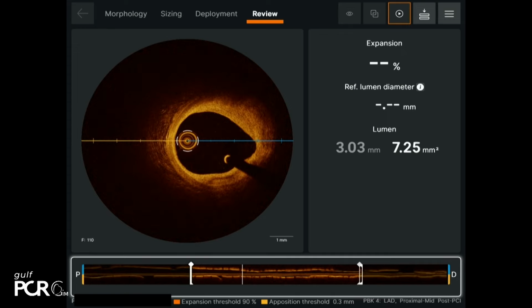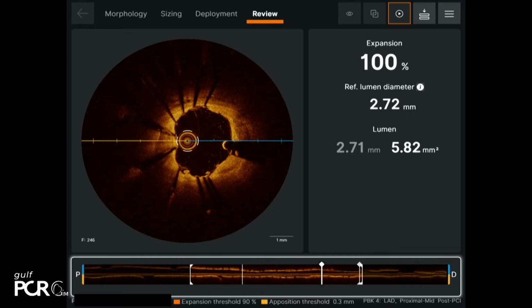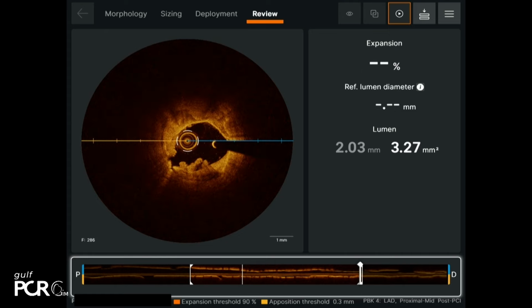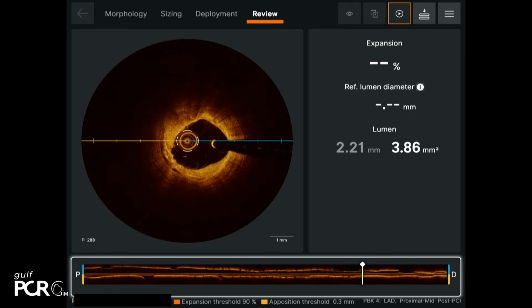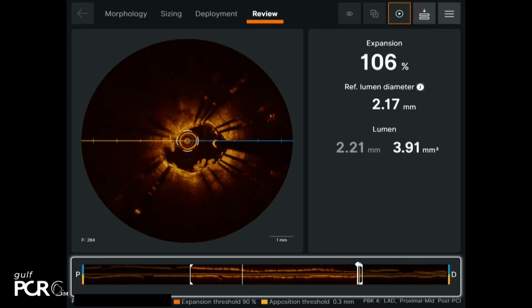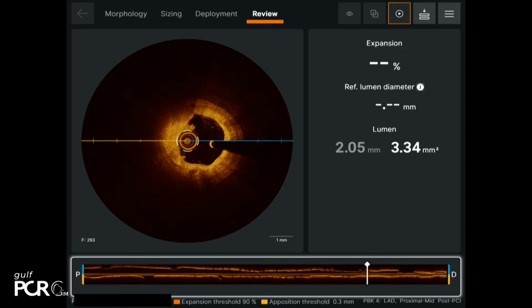What do you think, guys? Take a larger balloon only proximally, Khalid, just to take care of these malappositions? Or do you consider this very mild and not worth it? It is mild, Ibrahim. Personally, I would have left it, but we can do that with a 3.5 short balloon. But definitely the stent that was underexpanded distally is now better. Still, we have some clots, and I think this is a very reasonable result. There is no big dissection distal to the stent.